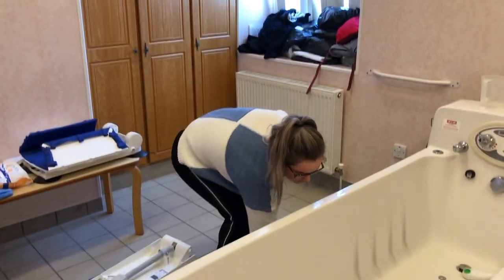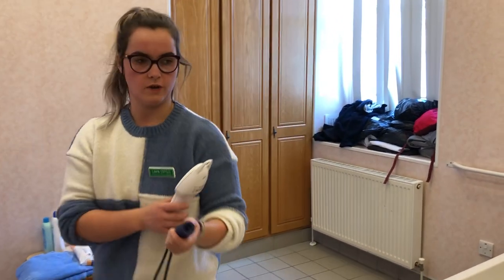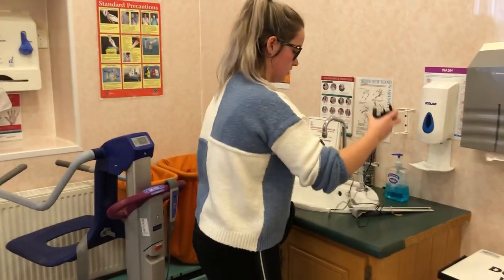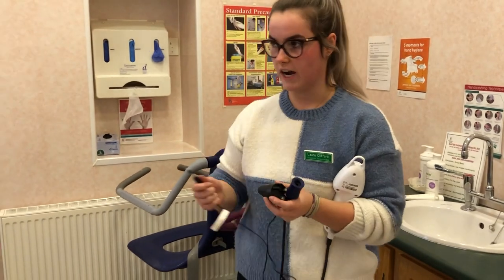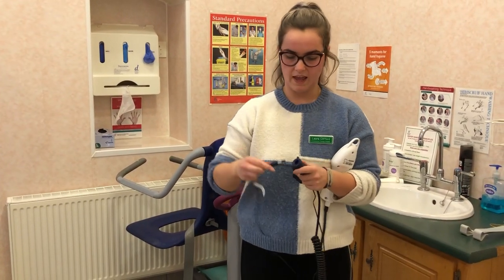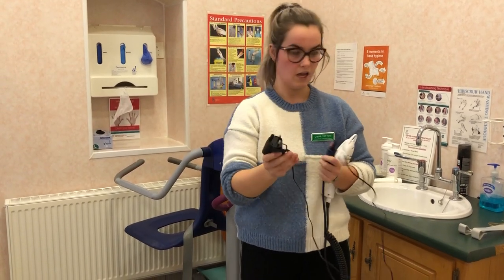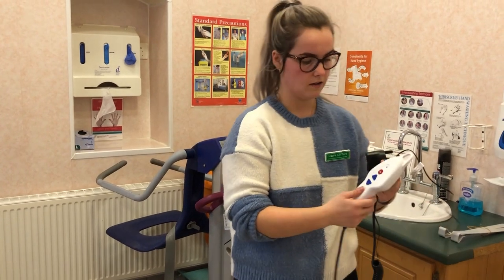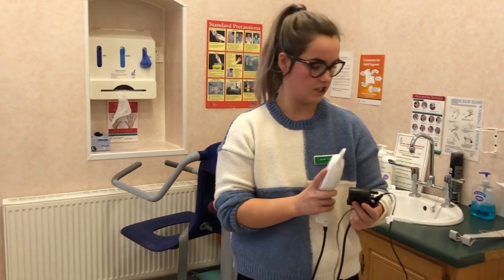It's recommended that you charge your remote after every use. This is the charger and you can charge it away from the bathroom — you don't have to charge it while it's in the bath. Take the remote away, push the charger into the connection, and plug it into the wall. The light will come on to show that it's charging.